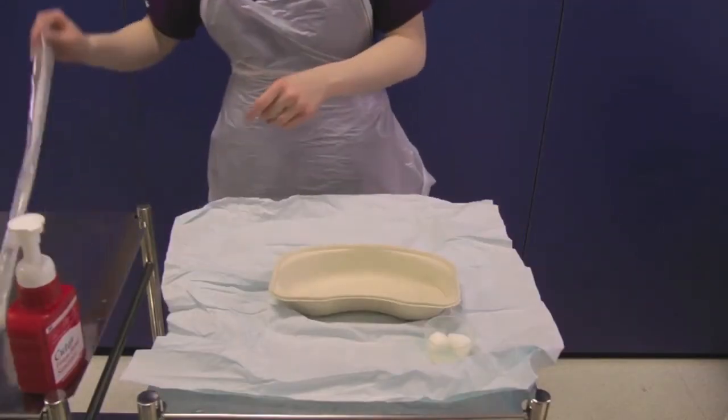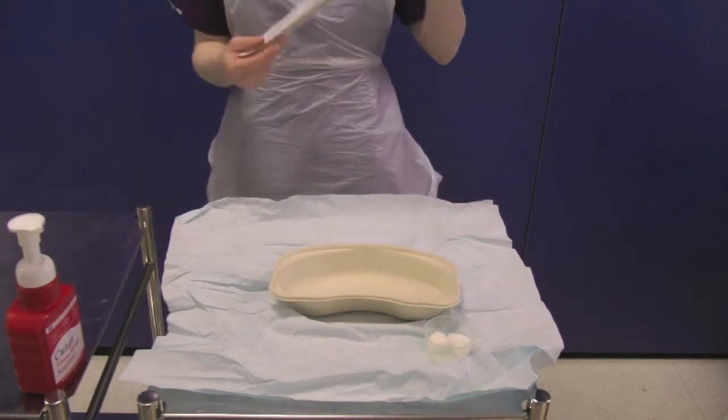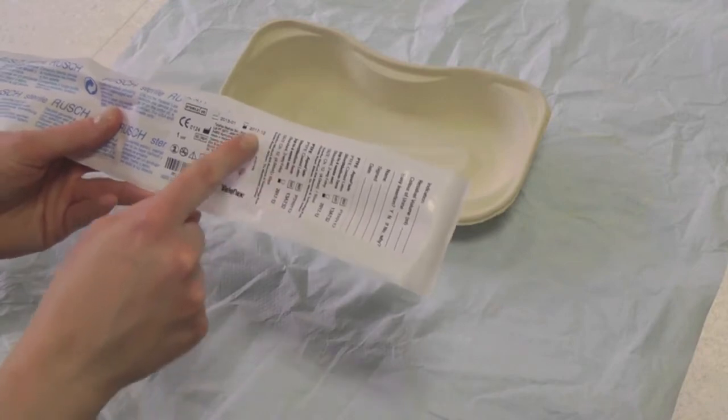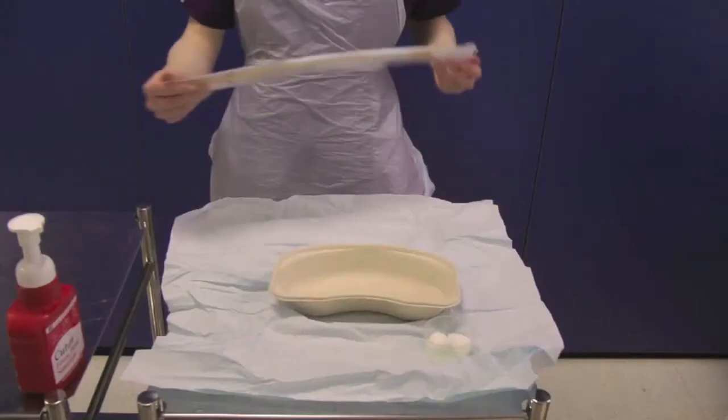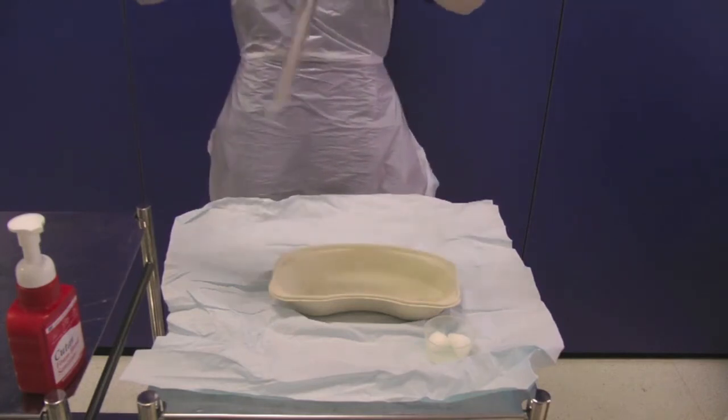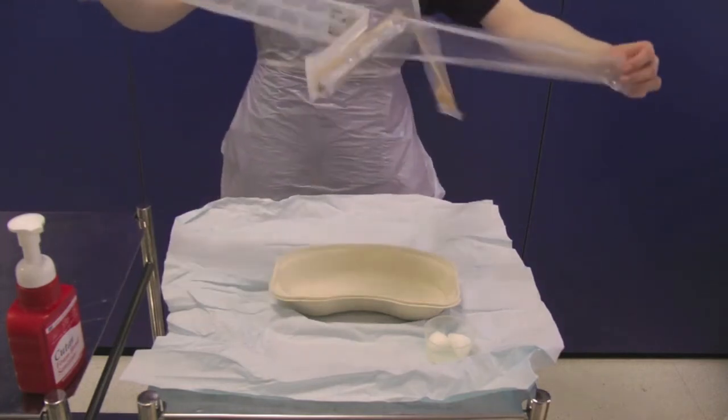Take the selected catheter, ensuring you have the correct size. Check the expiry date and note the stickers on the catheter pack that must be saved for use in the notes later. You can use both a standard size and a female size catheter in women. In this video, we use a standard size catheter.